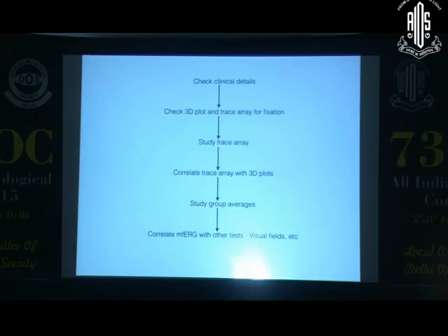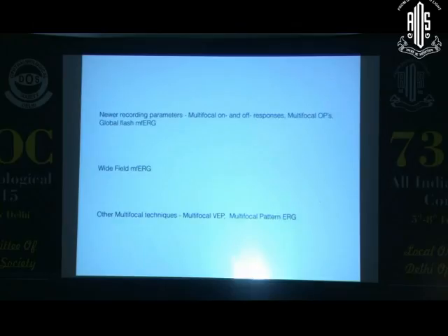In cases of HCQ toxicity, you have done a multifocal ERG. Now, most electrophysiological tests are subject to artifacts and recording errors. So always try to correlate with the visual field. If you do a visual field in the same area, say a 10-2, and you're seeing a visual field defect, then it's probably more in favor of HCQ toxicity. Based on this test alone, if everything else is normal, I would probably suspect it but still observe, and would not just stop the medications on this. So this was about multifocal ERG.